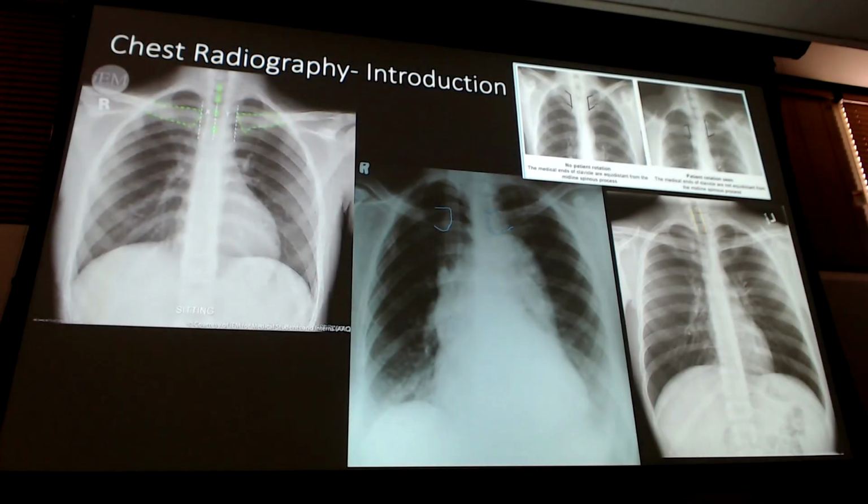Okay. The first picture is how things are supposed to look. The one on the far left. I have my spinous processes coming down and my clavicle ends meeting up with my manubrium and my sternum. Right here. Spinous processes, nice and straight, a little line in the center of the trachea, which is really the spine, but the trachea is right there, so we can see them very nicely. And the clavicle ends come right up against my manubrium and onto my sternum.